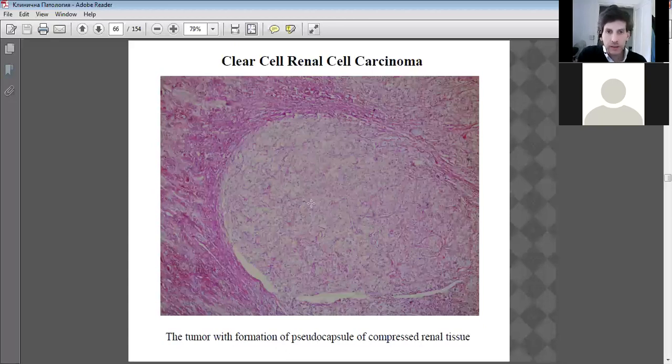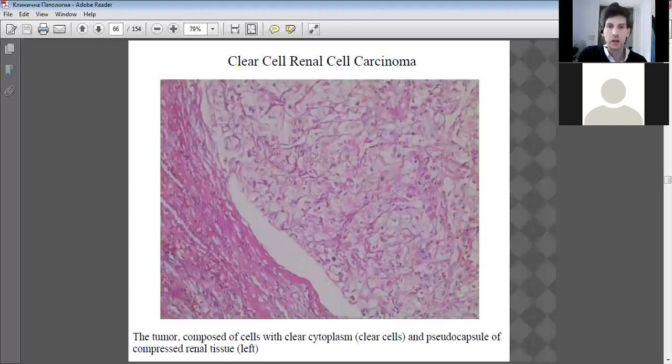Apart from that, I think the fibrous tissue is also disrupting the rest of the kidney function by compressing the tubules. A lot of tubules here are being compressed by the fibrous tissue as this tumor grows in size. Remember as well, the kidney is highly vascularized, and so the carcinoma is likely to spread within the bloodstream. Okay. Here's a very, very good slide indeed.